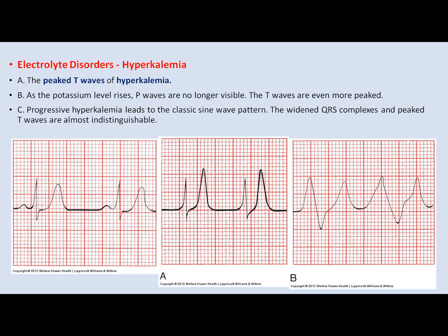Because this next thing what happens is this, with this one, these will merge, QRS, and form what is called a sine wave. Then the sine wave goes into ventricular fibrillation. So you have to treat this immediately, emergency treatment.